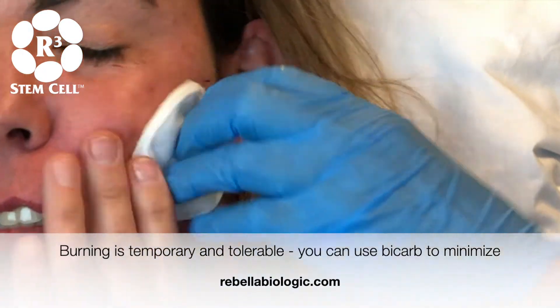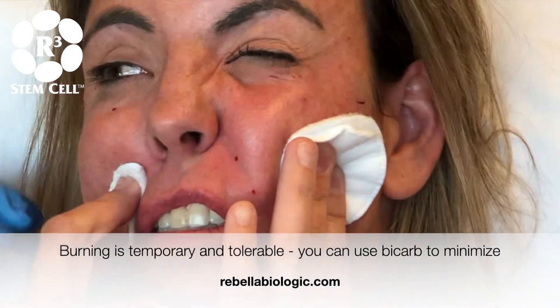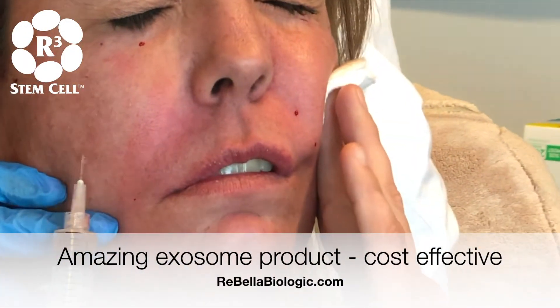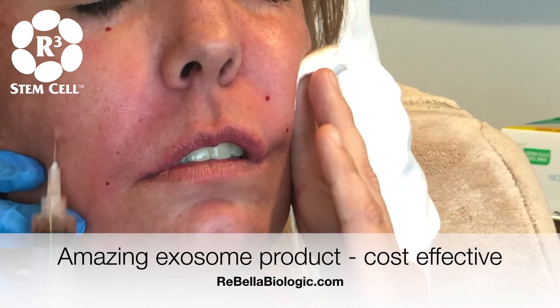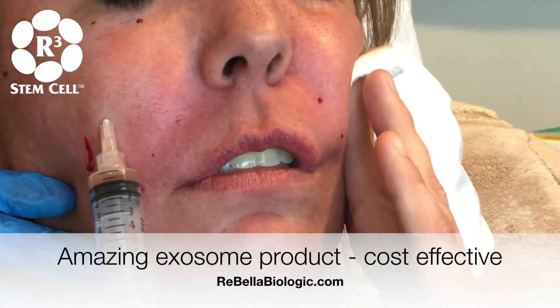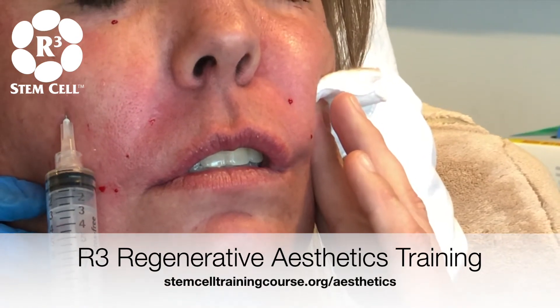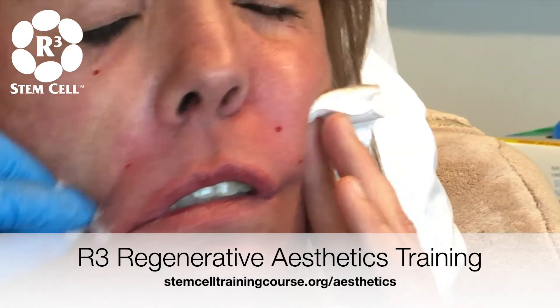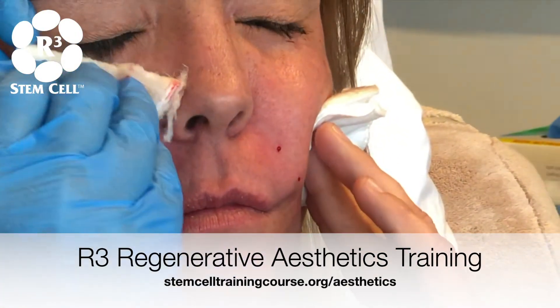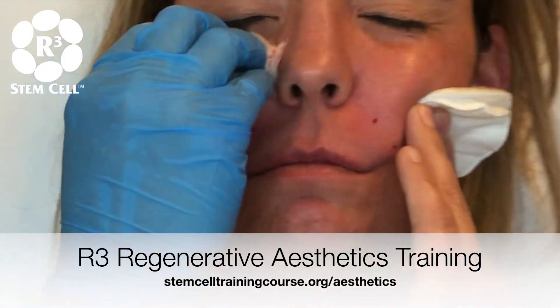Push your hand right over here. Do you ever mix bicarb with it? I do, I normally do mix bicarb. This side's not as bad with the acne as the other side. So how much bicarb would you put in that syringe? One CC. So to cut down on the sting, you can put one CC of bicarb and the sting lasts less than 10 minutes.